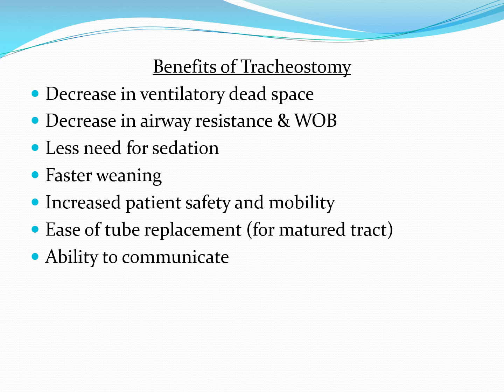Also, ease of tube replacement for a mature tract. Once the tracheostomy tube has been in place for a good month, that tract is nicely established. Maybe the tube's been changed once. From that point forward, future changes tend to be relatively straightforward. Also, ability to communicate. The less need for sedation that I just mentioned in the upper portion of this slide, and greater patient comfort, is about their ability to communicate, to eat, and things along those lines.